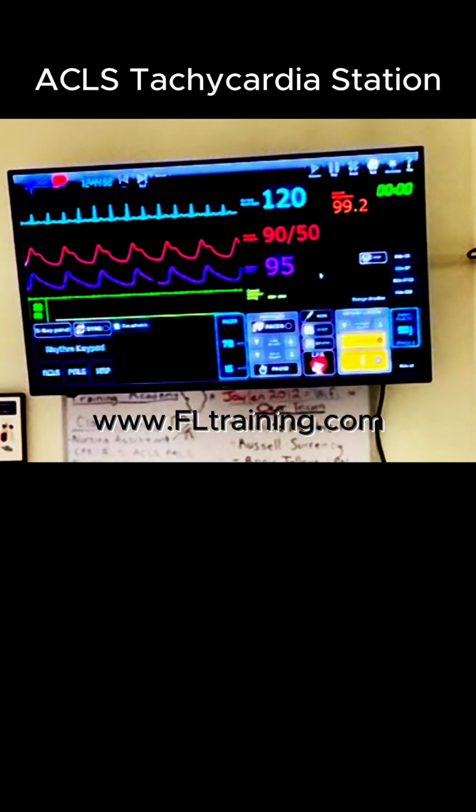Now, are we expecting for it to be perfect, being that she was drinking energy drinks and running? So right now we're okay with 120 as long as she is still stable and our blood pressure improved, our O2 sat improved. And so after you administered the 6 milligrams of IV adenosine and you used the synchronized cardioversion, she now no longer reports palpitations or any chest discomfort. All right, so we're going to observe her. Cardiologist is going to come in and they're going to monitor her, but we're also going to educate her on what lifestyle changes.